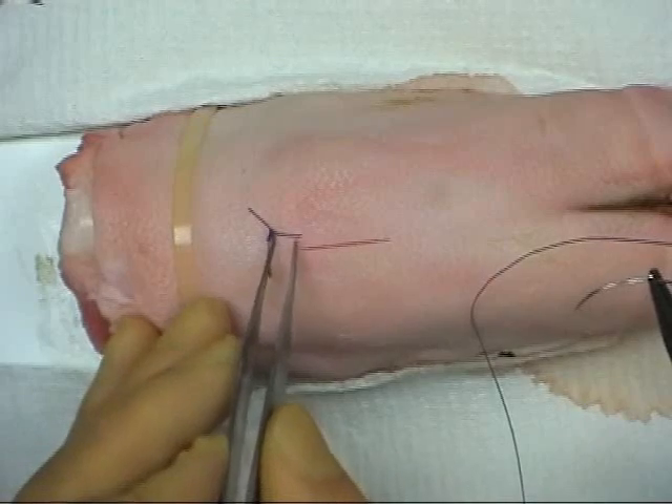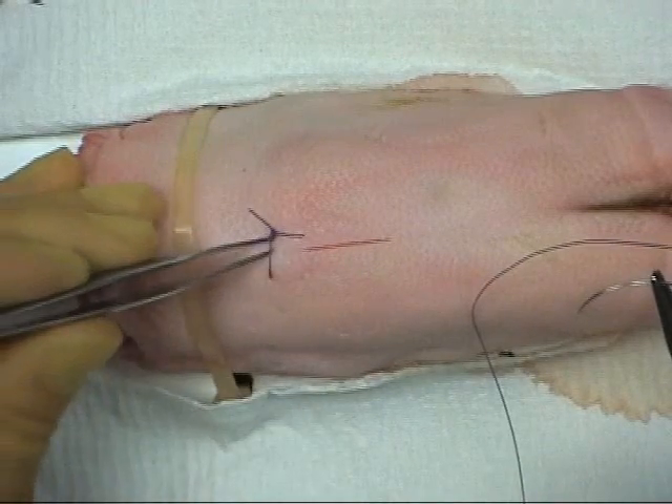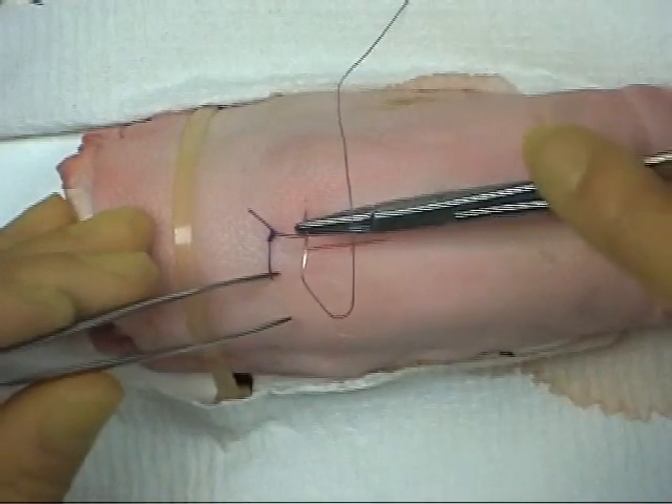To estimate the next bite placement, consider the distance of the first bite from the wound edge. The next bite should be placed at a point that is double this distance.